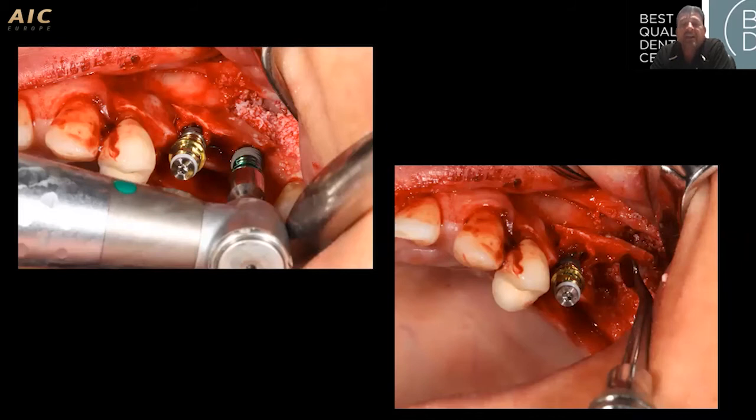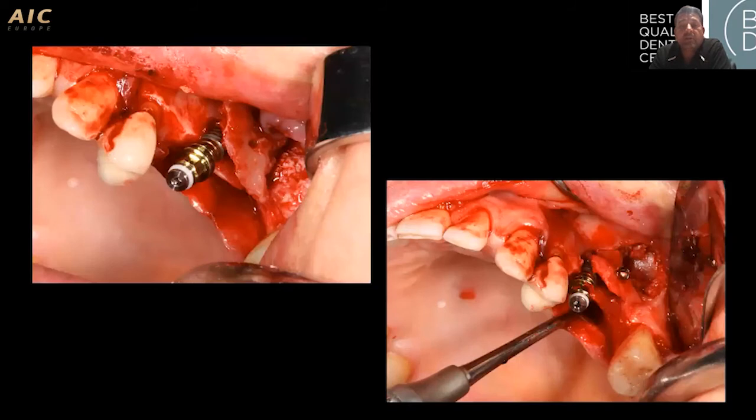And when we started to put a 4.0 implant on the 26th tooth, we had a catastrophic fracture in our procedure. So the bone fractured. I had to take the implant out, the molar implant, and afterwards we used a screw to fix and stabilize the bone fracture against the palatine bone. And with this procedure, we have very nice stability.